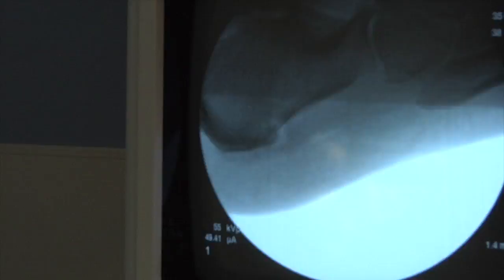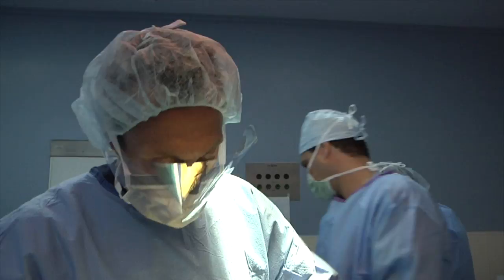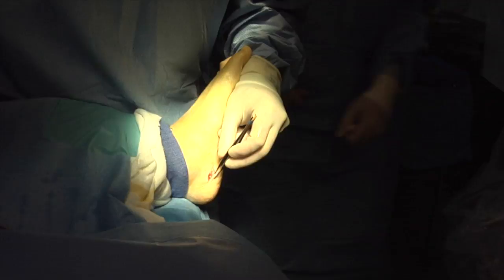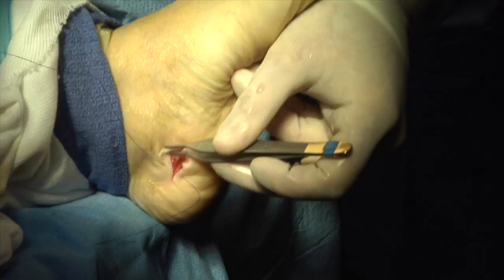Here's your finished product. Since this is a weight-bearing incision, I like to place something in there that's kind of a thicker nylon. You can't do real absorbables in these, but something called a horizontal mattress stitch will evert the edges. So it'll put tension on the side of the incision, but not at the middle.